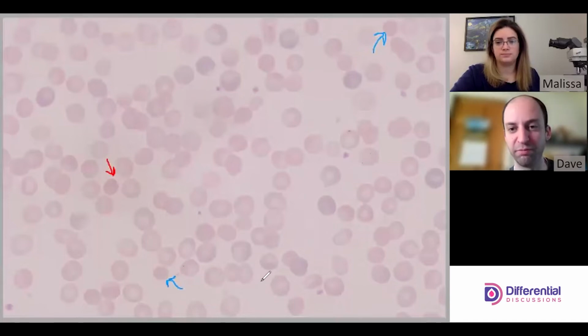Yep. And other morphologies in hereditary spherocytosis, I don't know that there are many other morphologies associated with HS. There might be others that are incidental, and you could find the occasional schistocyte, but for the most part, it's going to be spherocytes and then our polychromatophilic cells.